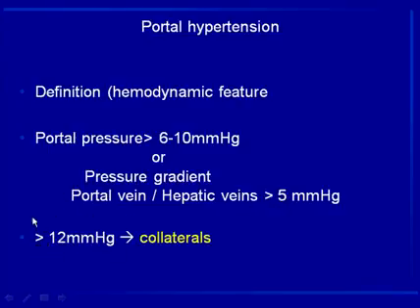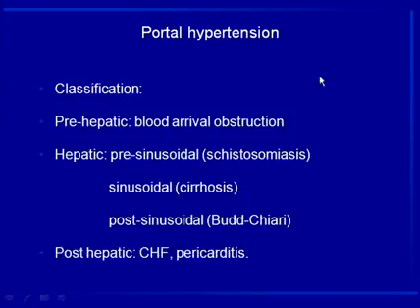When the portal pressure gradient is more than 12 millimeters, we identify collateral pathways, systemic collateral pathways.